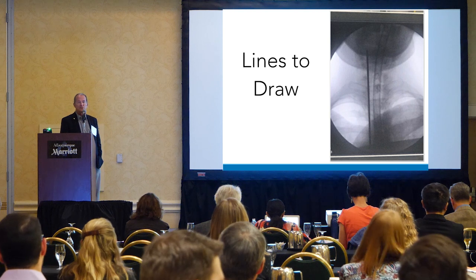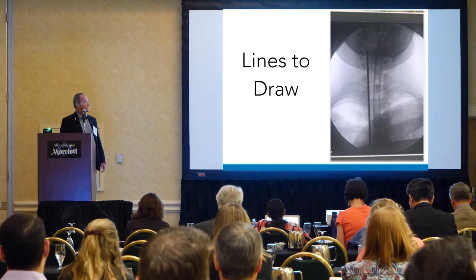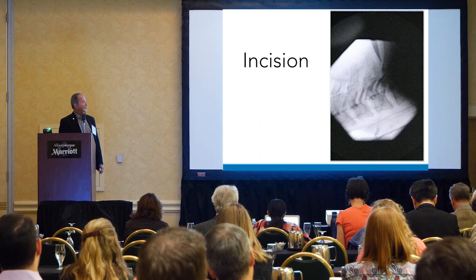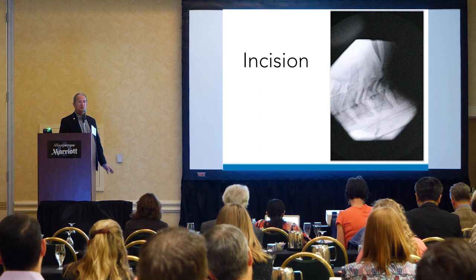The first line to draw is in the AP position. You put the guide rod up along the facet column on the side and draw a line. This is going to get you right in the middle of the facets. Next, I use a spinal needle to get myself parallel to the disc space at 6-7. I want to be just slightly distal to the disc space, since I have to go down to where the descending facet of 6 is going to be, which is a little bit distal to the disc space. Otherwise, if you're at the disc space, you have to do more work to angle down.